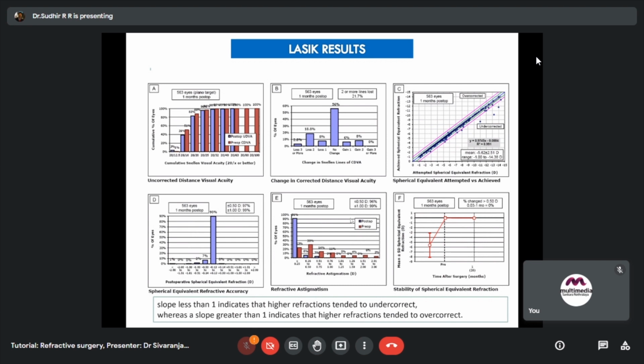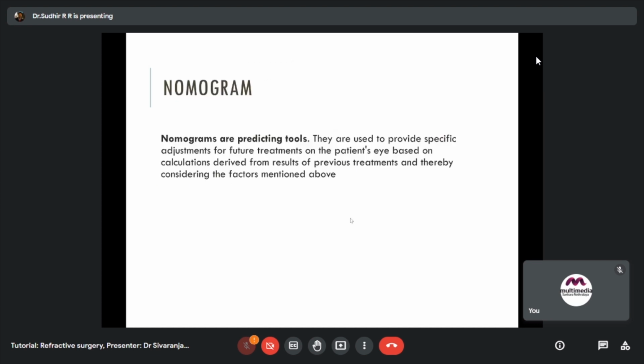And then if you are willing to go ahead, you go ahead with the procedure, or with the safety tests. We have not dealt with the safety tests here. There is a series of tests we do with Pentacam, specular microscopy, Corvis, all that, and then select the patient for the treatment. Okay. Go ahead. This we have already discussed.